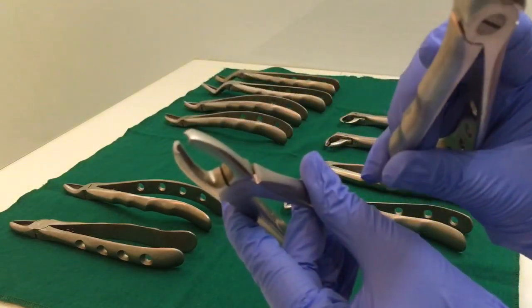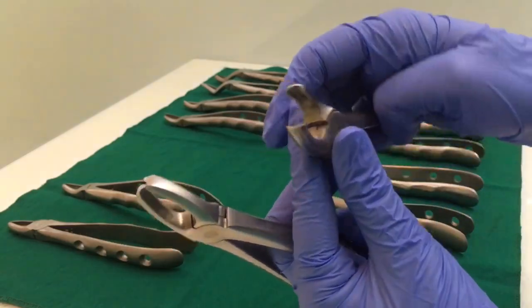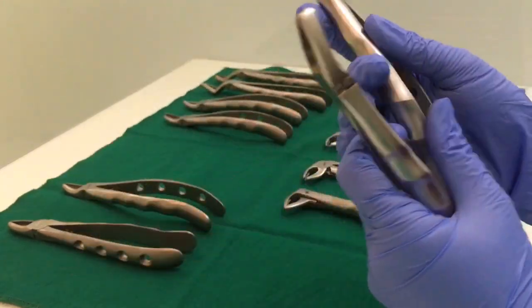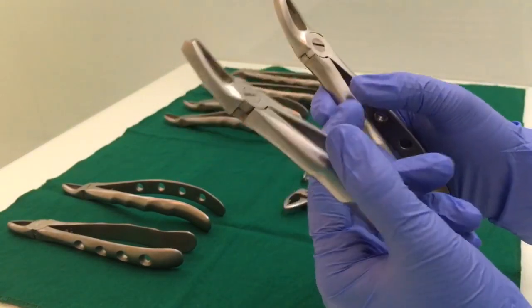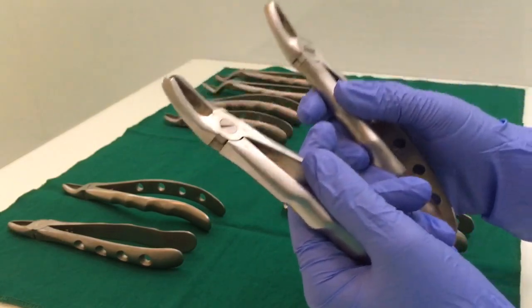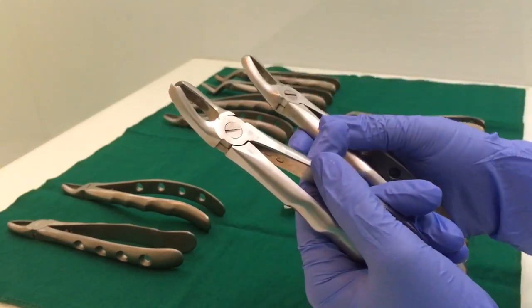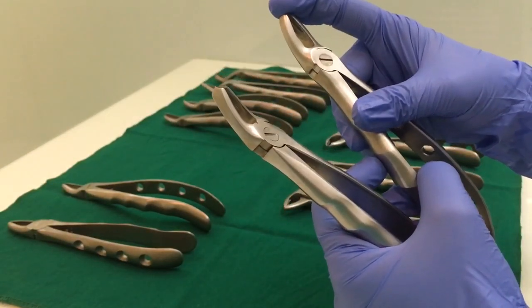This one is also an upper molar forcep. Same thing — it has two beaks: one is rounded and one is pointed. One of them is for the right side and one is for the left side. Both will have one rounded end and one pointed end. The pointed end will go and engage in the buccal furcation — the furcation area of the buccal roots. So basically, the pointed end will come on the buccal side.